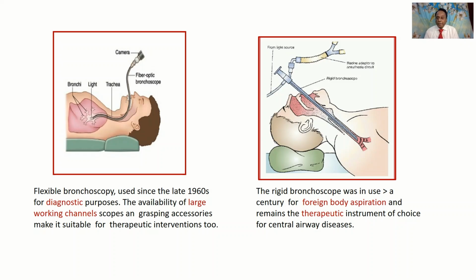It is also used for many therapeutic procedures. But with large working channels, even flexible bronchoscopy is now used for many therapeutic purposes, which we are going to discuss.